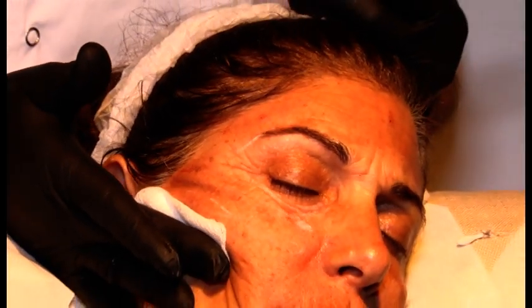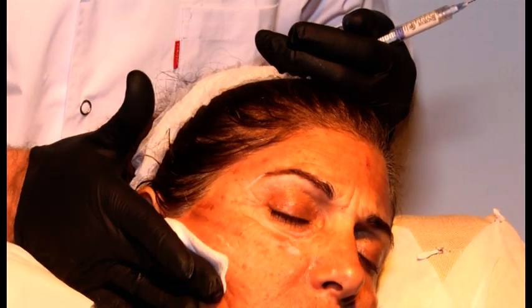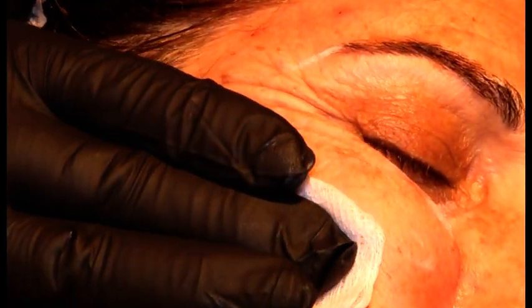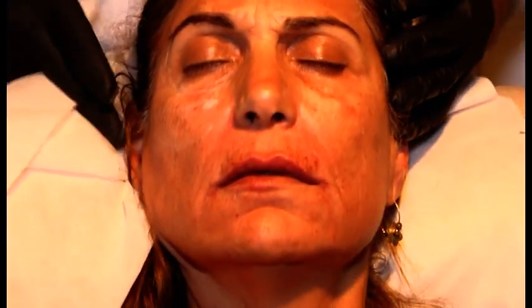It's rock and roll. So I push and I roll. I push and I roll. I push and I roll. So, straight. Look in the camera. Do you see a difference? Want to sit up?